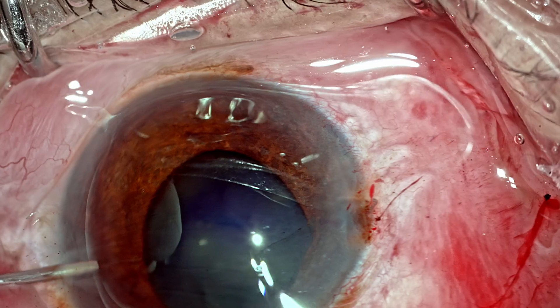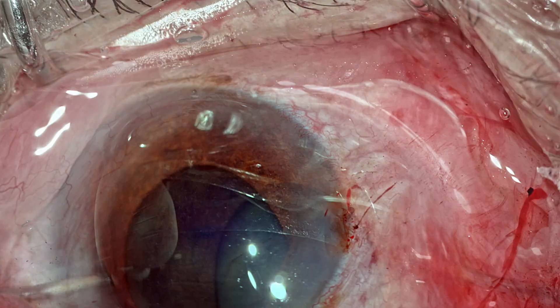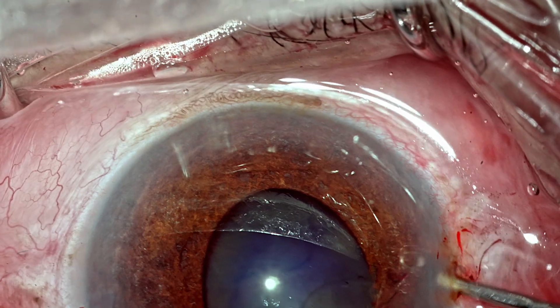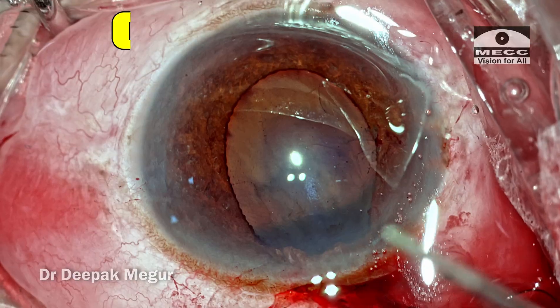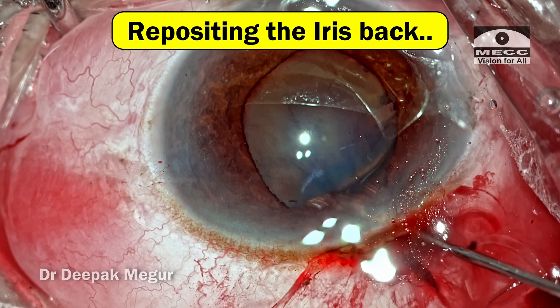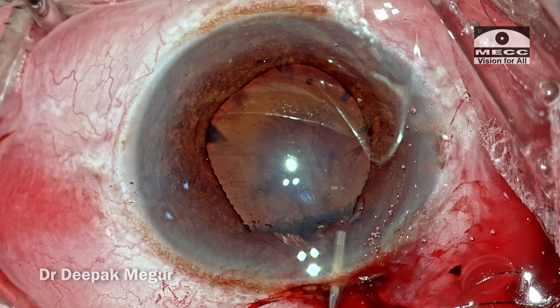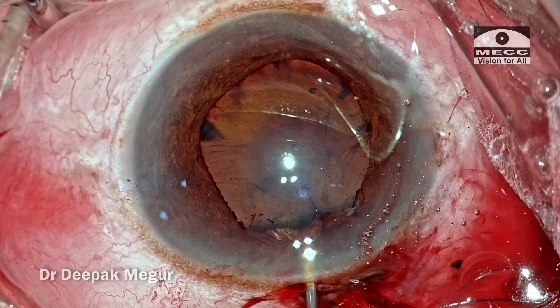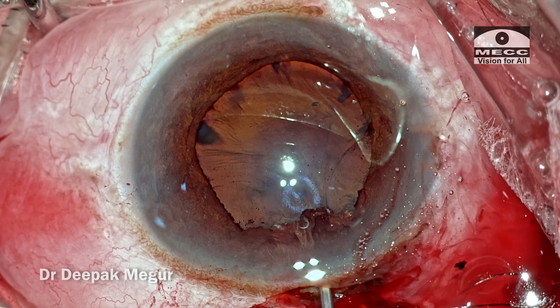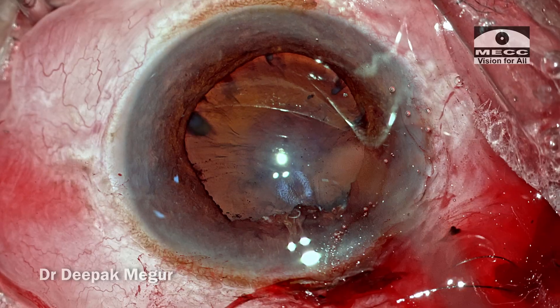Let out all the OVD which is there inside — let it come out. Once the eye becomes soft, that's the time when you can reposition the iris. When there is no positive pressure from within the eye, the iris would go back when reposited. When you have got positive pressure pushing everything out and you try to push, you're not going to be successful in putting the iris back — you'll only be successful in shredding the iris.